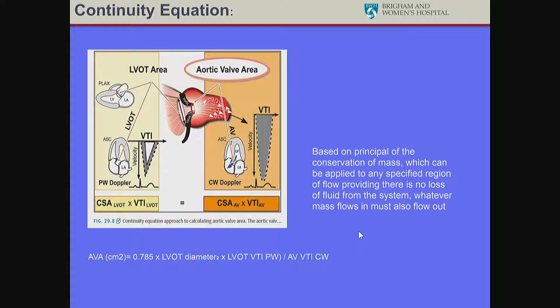So this other equation, which represents a workhorse equation that is utilized every day in busy echo labs, is the continuity equation. Now the continuity equation is summarized in this slide, and it is based on the principle of the conservation of mass, which can be applied to any specified region of flow, providing there is no loss of fluid from the system. So whatever mass flows in must also flow out.